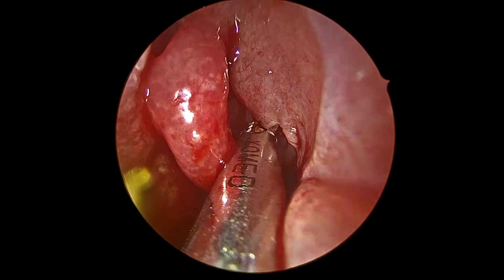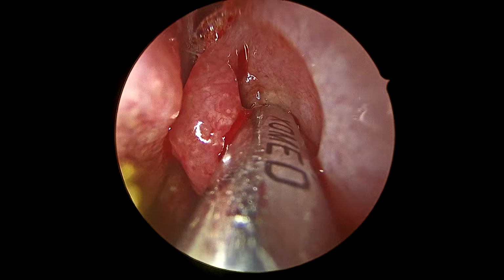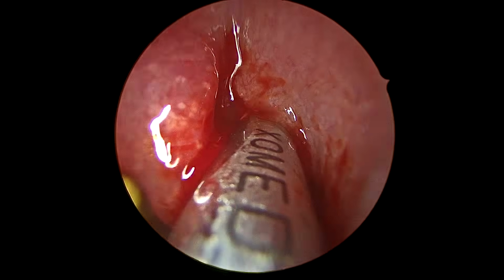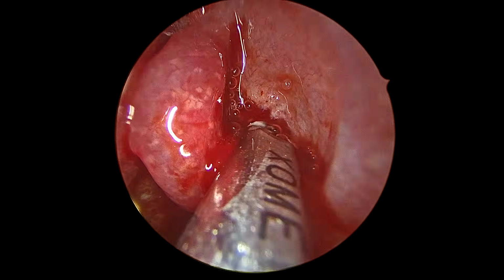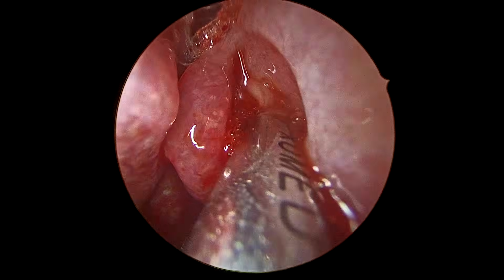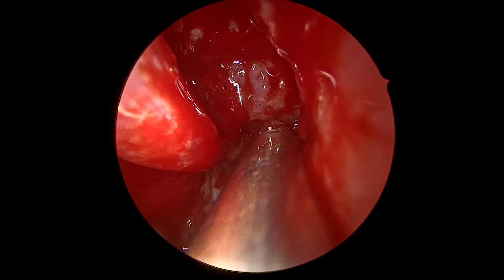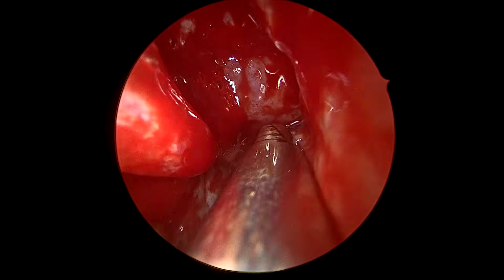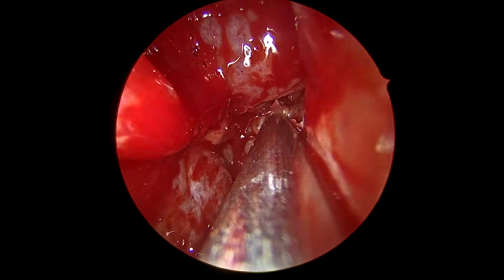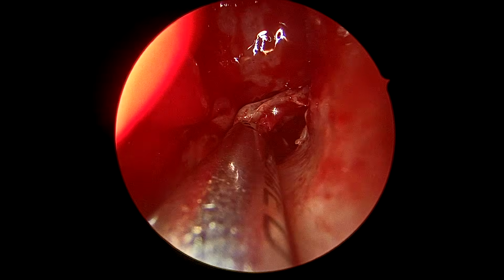Basically, while doing uncinectomy, you do it at the shoulder of the uncinate process, which is a boomerang-shaped bone. It forms the hiatus semilunaris, which opens into the maxillary sinus through the infundibulum. So you see, I have removed the vertical portion. There was no need to remove the complete vertical portion of the uncinate process. I just wanted to see the attachments or any extension inside the maxillary sinus.